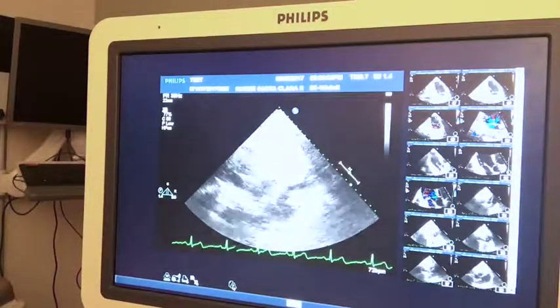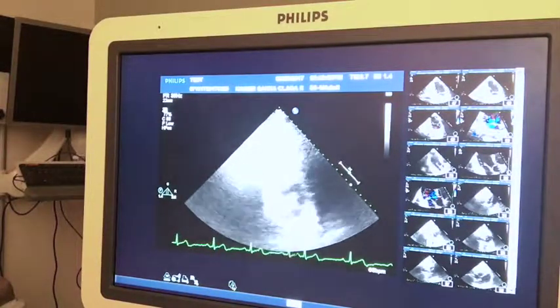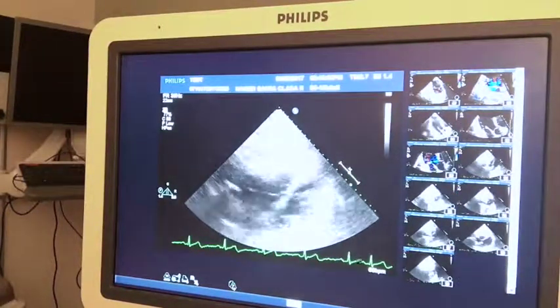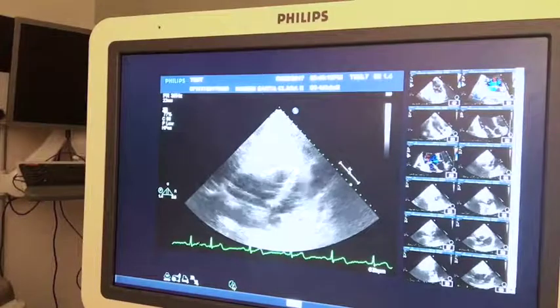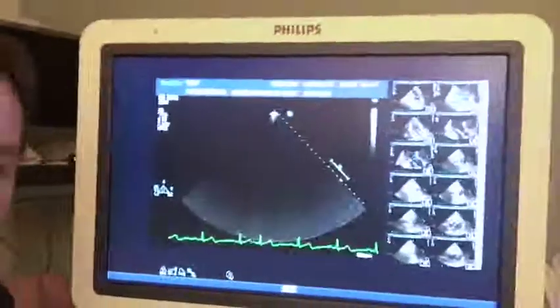If you take the time to instruct them in that way, then you'll get a really nice sniff. It'll happen when you're asking for it, within the 2 or 3 second loop that you were doing. So you won't have to recoach and recoach, because so many of my students made the attempt, but the timing of when the loop actually captured misses the collapse of the vena cava altogether. Okay? So I hope this was helpful.